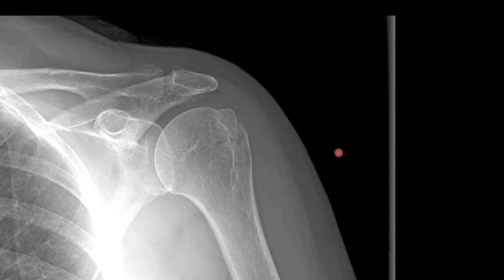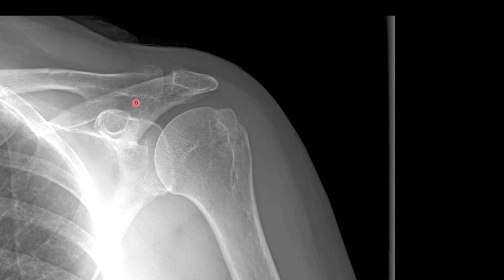Here's our first case with an external rotation view of the shoulder, just to get you oriented. This is the humeral head with the greater tuberosity. Here's our glenoid, the coracoid process, the clavicle, the acromion, and the AC joint.